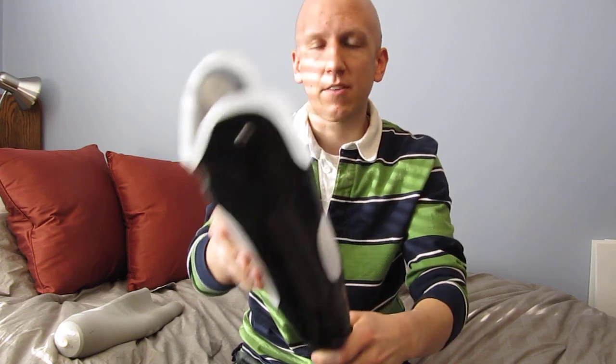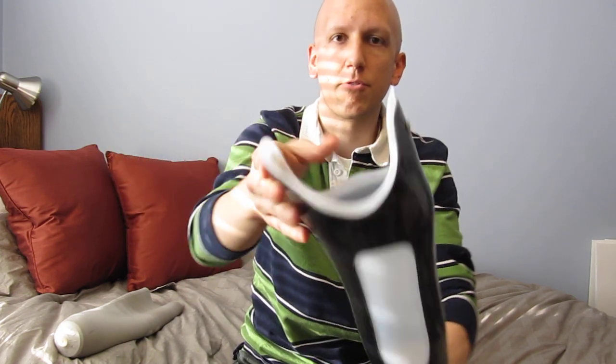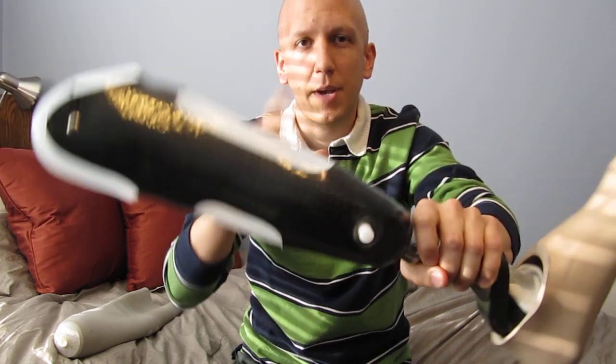The plastic is attached to the carbon fiber with glue and these two screws. At the bottom there's no attachment — it's just suspended in there, allowing it to move even more.